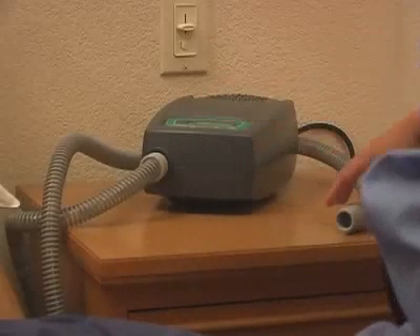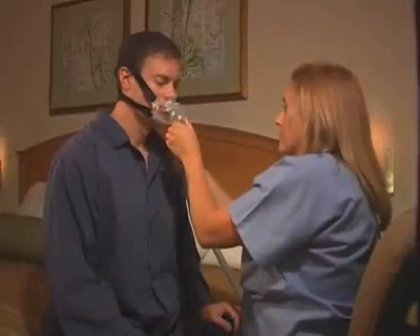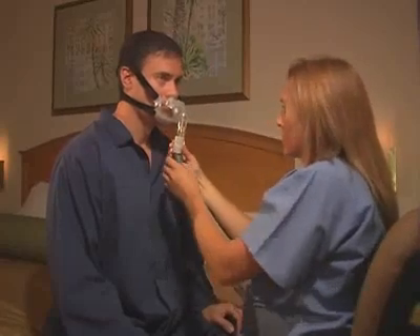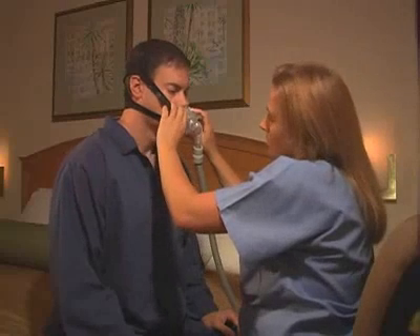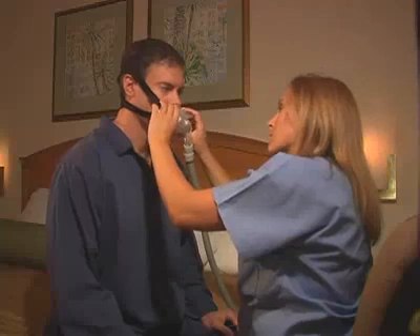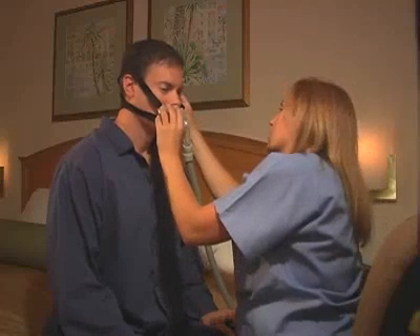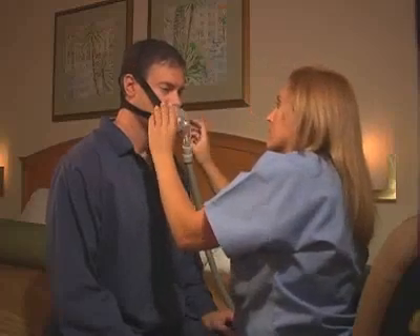Turn on the pressure device and make sure it's working properly. Attach the tubing from the pressure device to the swivel coupling on the hybrid. Once attached, the patient should breathe normally. If there are air leaks around the oral cushion, lift the mask slightly off the face and reposition. You may also continue to make minor adjustments to the nasal pillows and the headgear as necessary until you have a comfortable fit with minimal air leaks. Do not over-tighten the headgear straps as this may create discomfort.